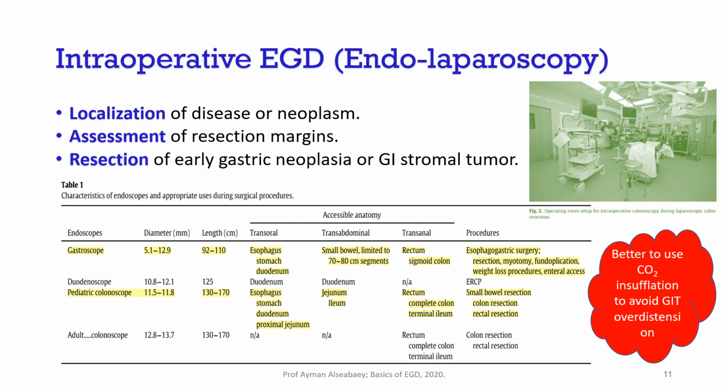And this new concept helped us also in another new point, that by doing intraoperative EGD with surgical backup, actually there is no more contraindication for endoscopy. There are no contraindications for endoscopy with such a concept.